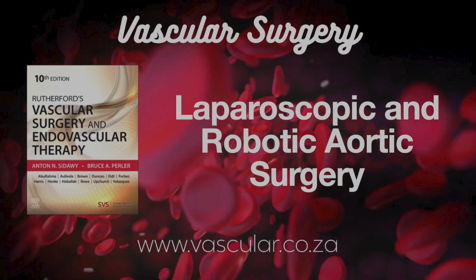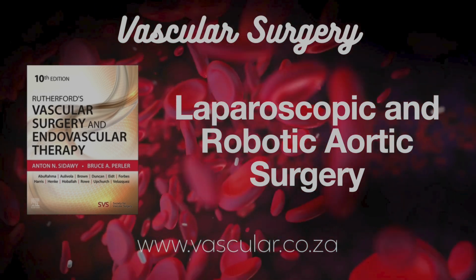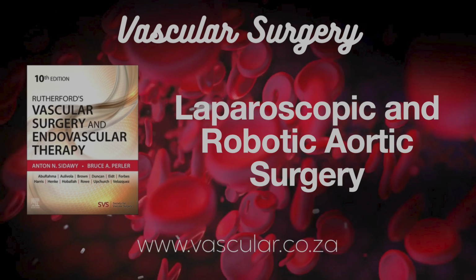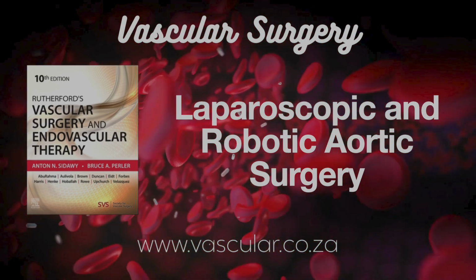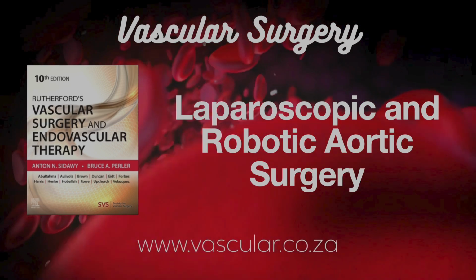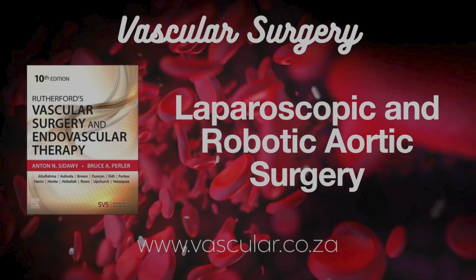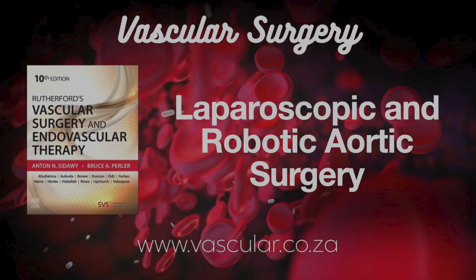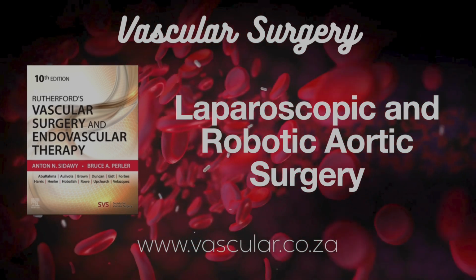Definitely not. And the book highlights the robot helps beyond just sewing, improves visualization, makes dissection easier. But the big hurdles remain. Cost. Huge cost, right? Massive cost, yeah. And setup time in the OR. Although, interestingly, the learning curve specifically for robotic anastomosis seems potentially shorter than for pure laparoscopic sewing. Faster to learn the sewing part, maybe. That's the suggestion. They even mention using robots to fix type 2 endoleaks after EVAR sometimes.